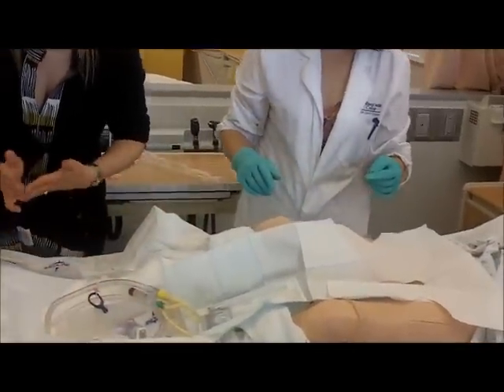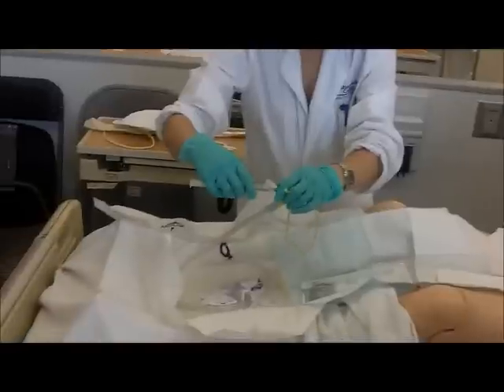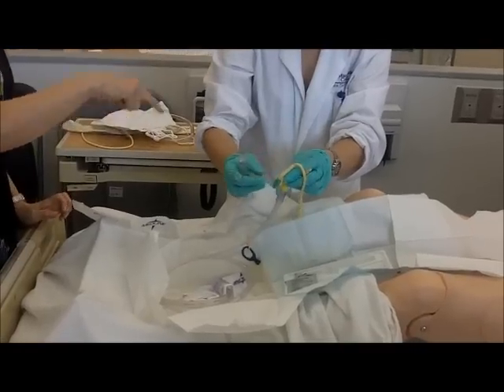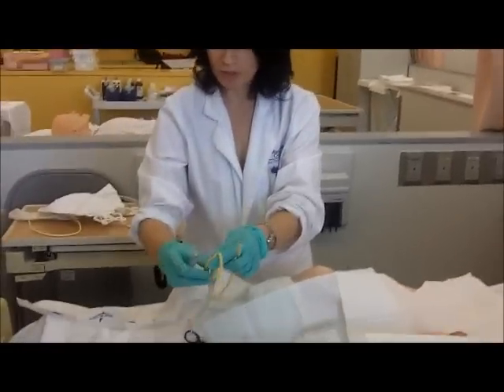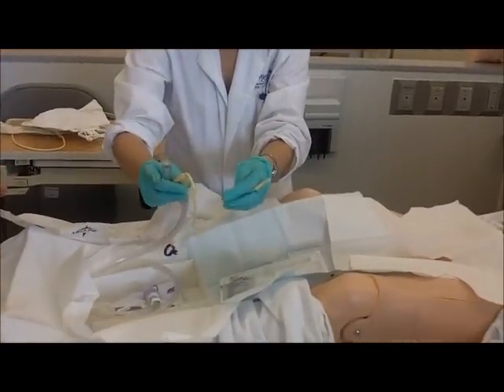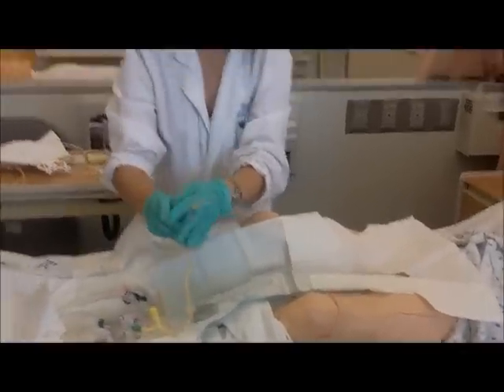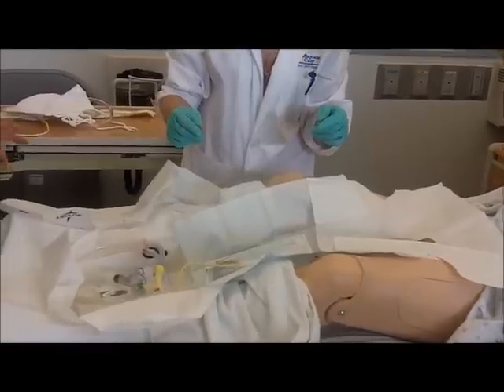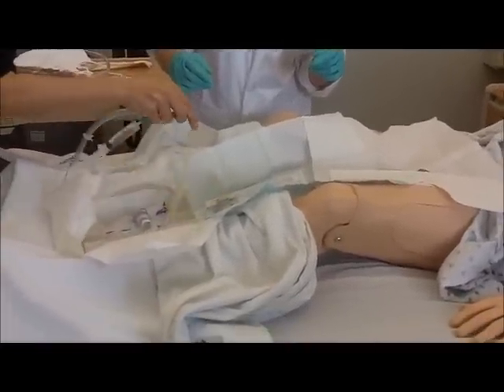So go ahead and practice with that. You just want to make sure that when you're taking it off, this isn't flying around or hitting a non-sterile surface, because that will fail you. We're not doing all of the securing it to the leg? What you're going to do is you won't secure the leg because we don't have the device. But once she puts it in there, I'll show you how to secure it to the bed and then it'll hang over here. You can just go ahead and insert. Once you are comfortable in the hospital inserting Foley catheters, it takes no time at all. It's just a matter of making sure you know which hand is clean and which hand is dirty.